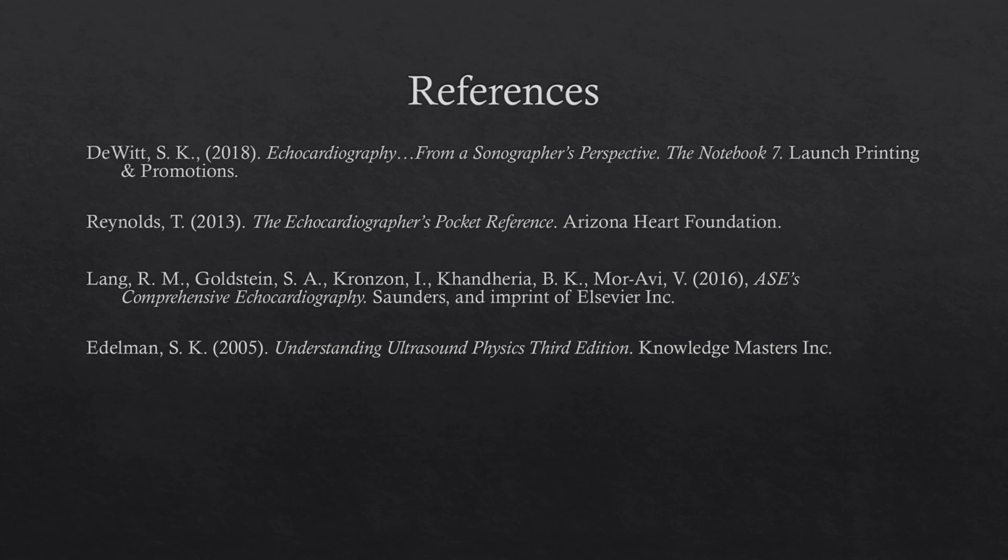So there are a lot of things that we do that are incorporated in a full echo, but for the purposes of this presentation, we were just talking about obtaining these basic views for a transthoracic echocardiogram.